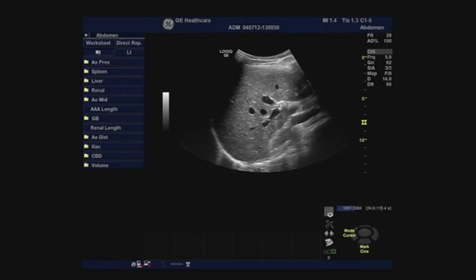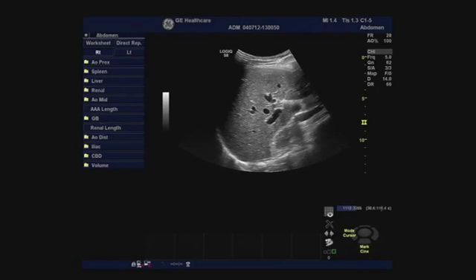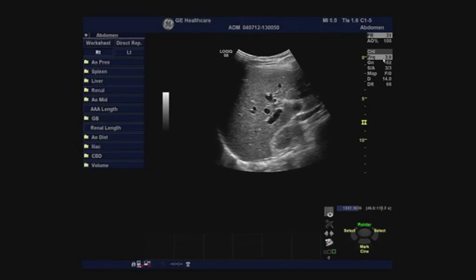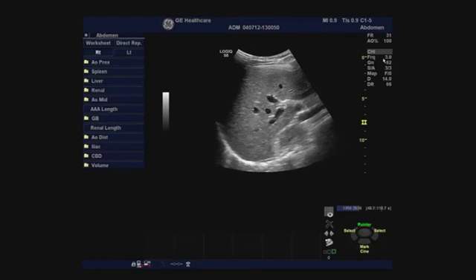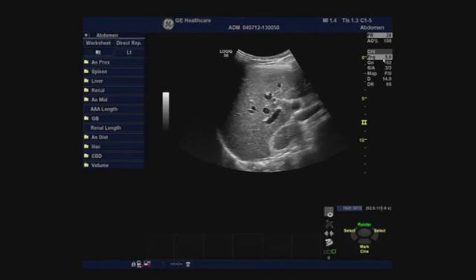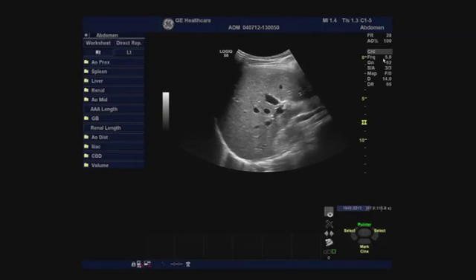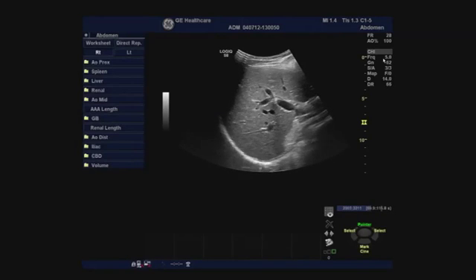So 5 is the highest frequency on this transducer, and you can see on the monitor itself, it tells you that I'm using 5 megahertz. But just look at the image when I reduce the frequency. So this is 4 and 3. So 3, the resolution isn't as great as 5, but if I had a big patient, you would actually see the difference in the fact that I could get further afield. You also have independent frequency change in B mode as well.